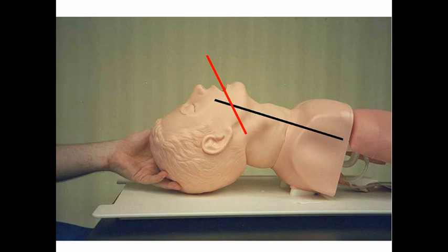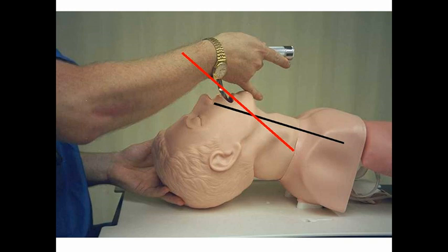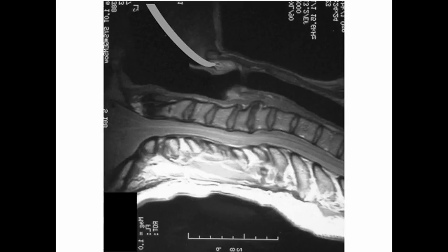Now, back to our airway maneuvers. Remember that during mask ventilation, the final maneuver was the jaw thrust? Well, we're not going to do a jaw thrust, but we're going to do something very like it. Instead of using external pressure on the mandible to push the jaw upwards towards the ceiling, we will use the curved blade of the laryngoscope to lift the mandible up towards the ceiling from the inside of the airway.